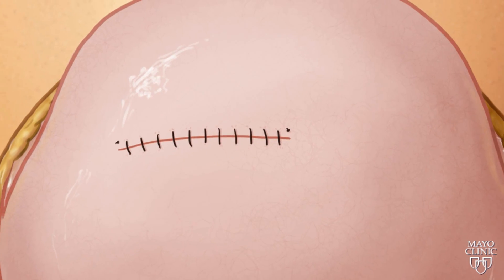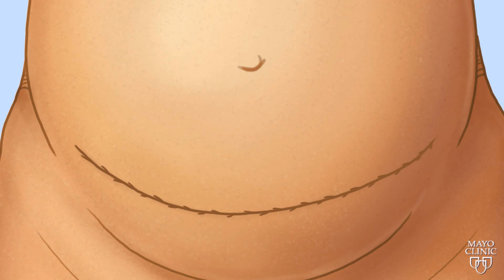Then they close the uterus, replace it into the mother's abdomen, and close her incision.